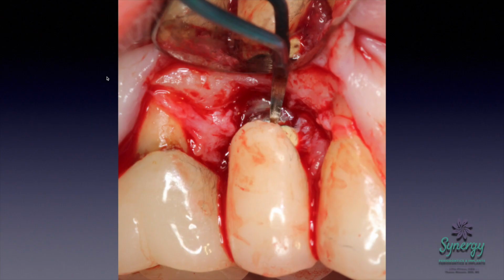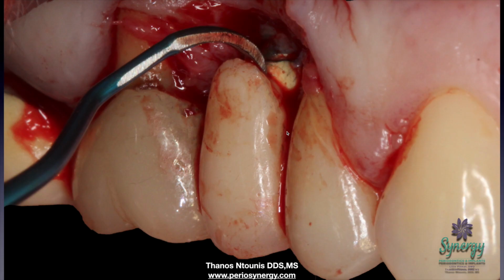Now, of course, the site preparation wasn't as adequate. So upon elevation of full thickness flaps, this is what we see here. You would expect that to be cement. I expected that also. Obviously, it's not the case upon closer look. This is part of the crown. The crown literally has a saddle design to it to mask that deficiency, and it's extending way, way apically. The amount of bone loss is rather minimal.